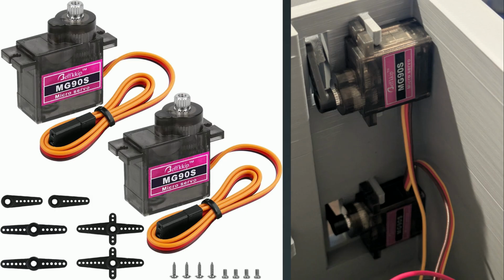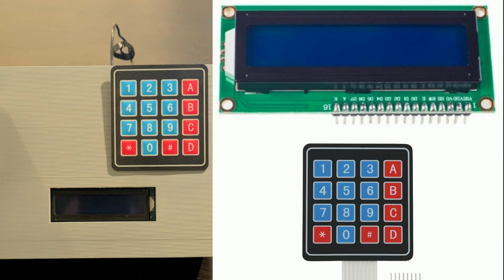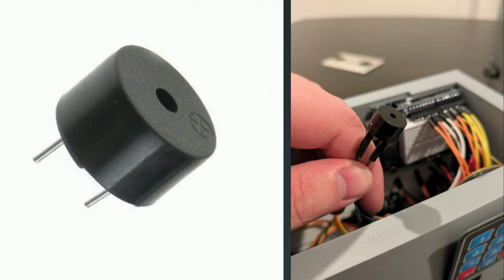In terms of the actuator, I used some 9-gram hobby servos that allow me to, in this case, flip up and down the top and bottom of a container. And lastly, for my display interface I used an LCD screen, a 16 by 2, so that I can display messages to the user. And in terms of user input, I used a keypad because I wanted the chance to have them input digits that will turn into times with the program. And an extra component that I added was, of course, my buzzer, which plays my jingle when the dispenser is ready and has dispensed the pills.